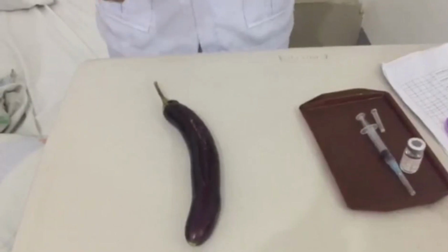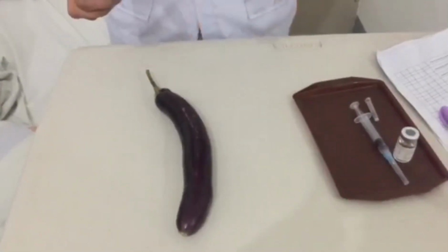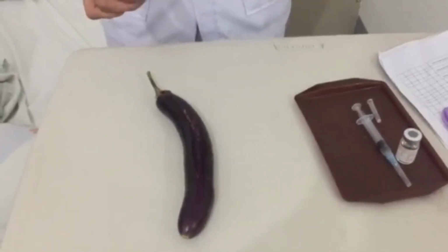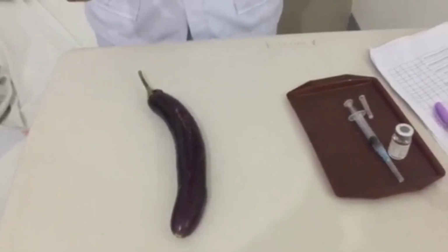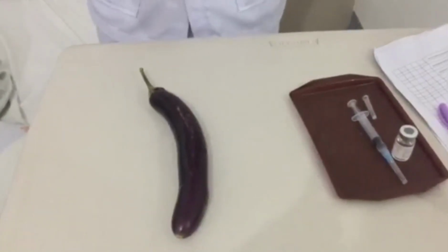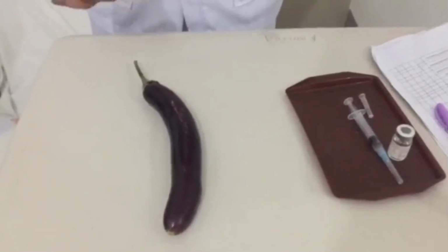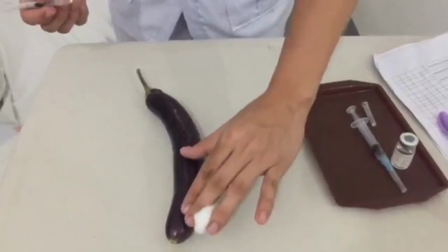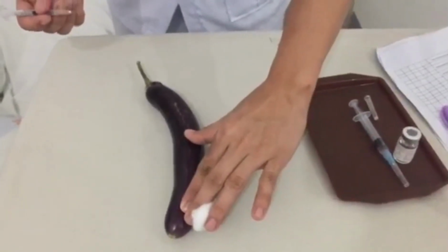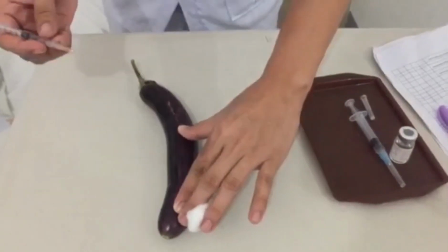And then I will inject the medication. Grasp the syringe in your dominant hand by holding it between your thumb and finger, with palm facing upward for a 45 degree angle insertion, or with the palm downward for a 90-degree angle insertion. Prepare to inject. Using the non-dominant hand, pinch or spread the skin at the site and insert the needle using the dominant hand in a firm, steady push.